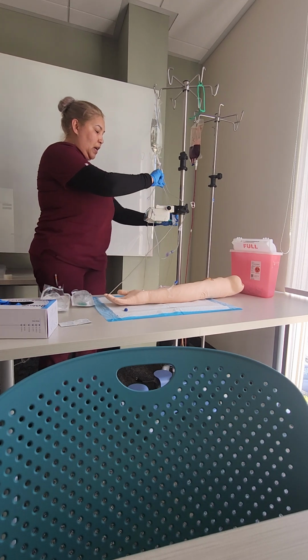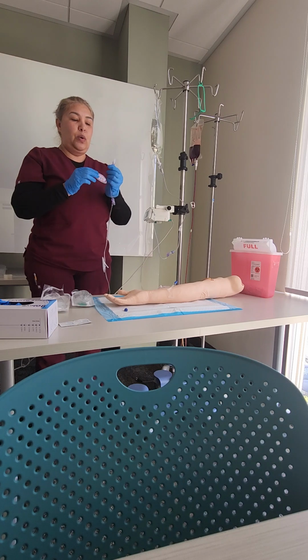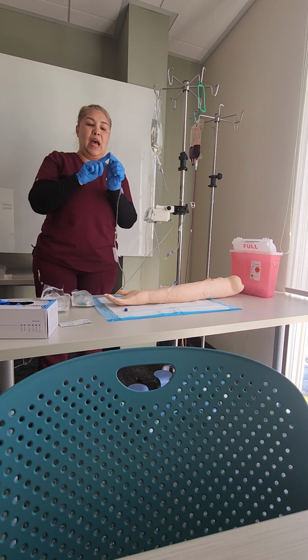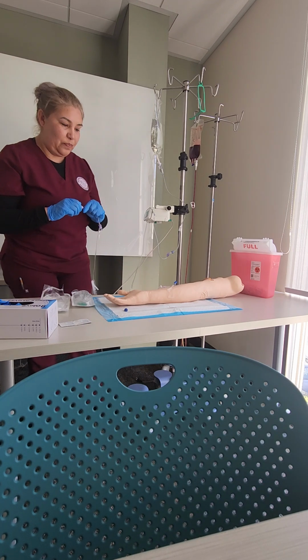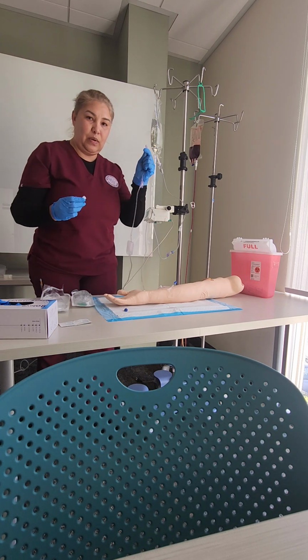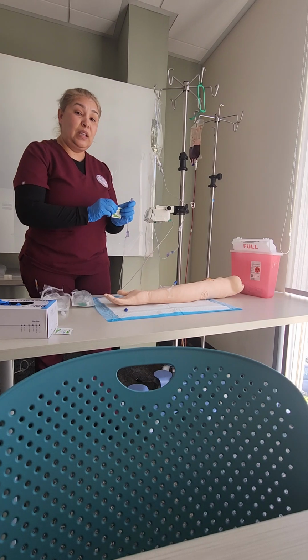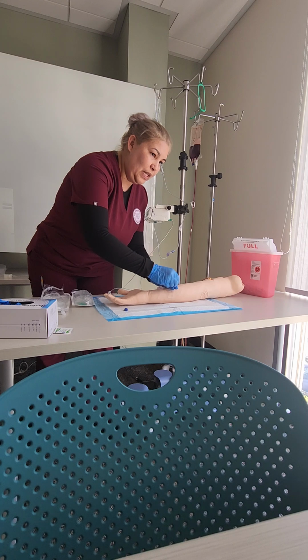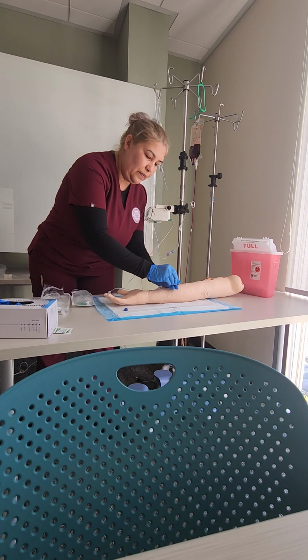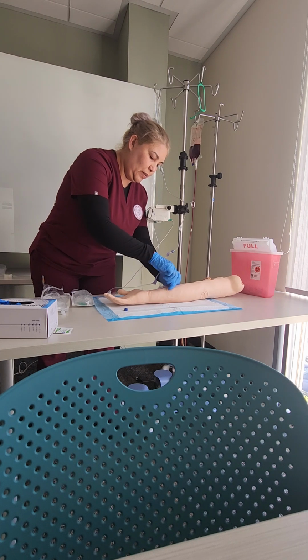And now that I am ready, I want to insert my fluids. So this is still fully intact. I never removed the tab, so it is fully clean. Oh, I haven't started it, that's why it's beeping on me. So what I want to do is maintain sterility. I do not want to touch that. However, I do want to clean the hub again. Okay, so clean the hub, 30 seconds. And now I want to insert my fluids.